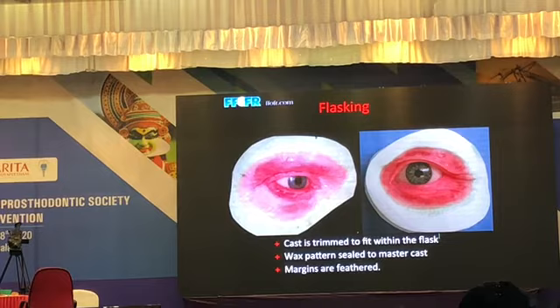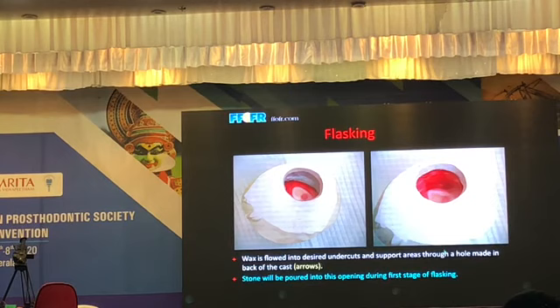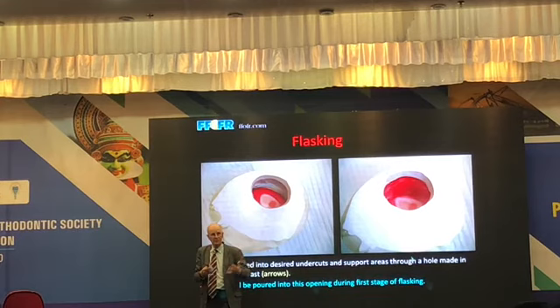Now, you have to understand how to flask one of these things. The technicians don't know how to flask this because they flask dentures, right? So you can't just say flask it. What are we doing here? We're looking through the back, and there's a big hole in the back of the cast, right? But we want the prosthesis to engage parts of the defect. That will help stabilize and retain it.